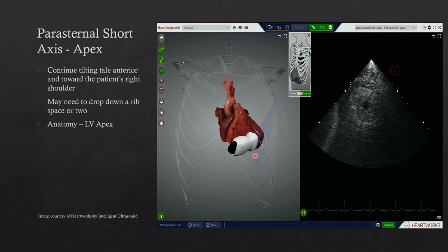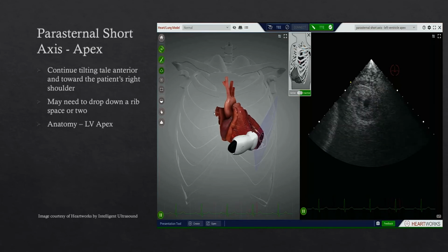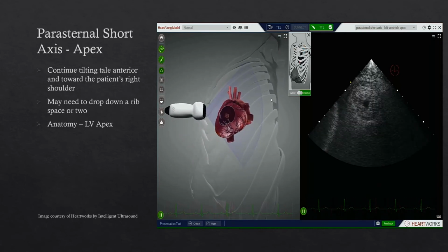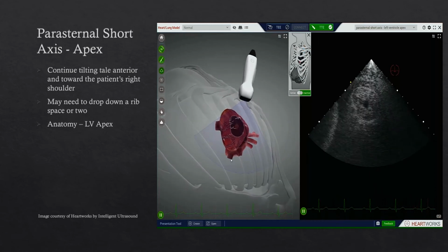But we're really taking a good look at this to ensure that the apical portion of our left ventricle is functioning well, okay? So you really just need to get down and see this kind of donut-shaped feature right here, a little tiny circle in there in the middle. That tells us we're right down toward the apex of the heart. That's what we should see there, and here's what we see anatomically.